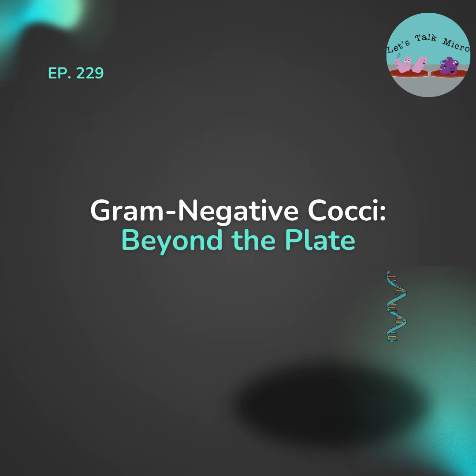That is a heavy inoculum, so you definitely need more colonies. And that means if you have the organism mixed with others, you might have to isolate it first so you can have enough to run it on the system. So, bottom line, results take longer than other methods. One thing that is mentioned for this card is that Neisseria flavescens or mucosa might be misidentified as Neisseria sicca, but it mentions in the package insert some tests to rule them out.